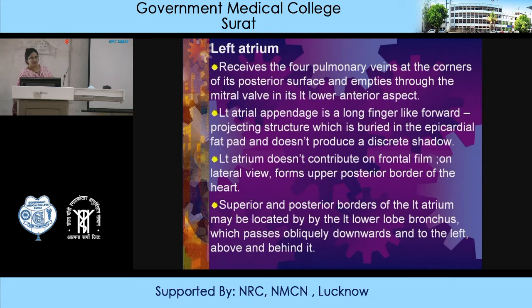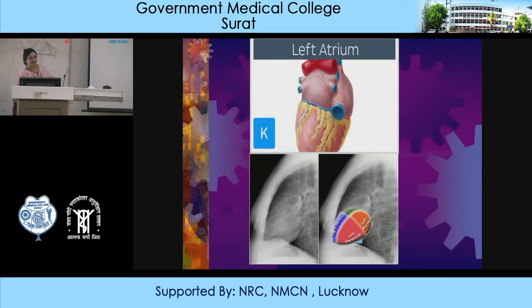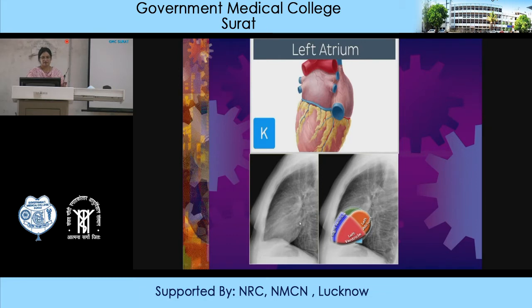You can see the pulmonary veins entering into the left atrium. On the lateral view, the right ventricle predominantly forms the anterior aspect of the heart and is in close relation with the sternum. The left ventricle forms somewhat the posterior border; however, the upper posterior border is formed by the left atrium.